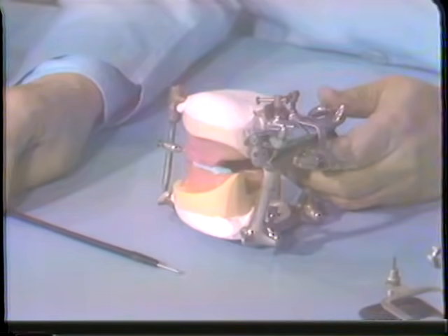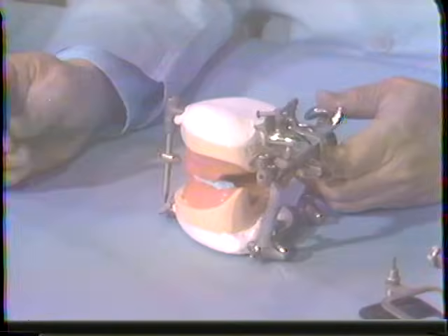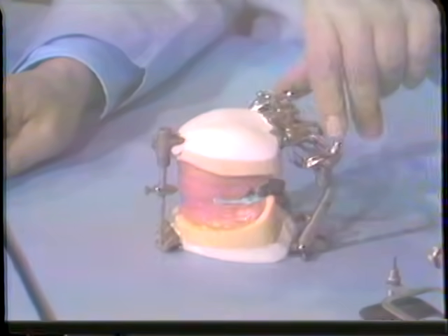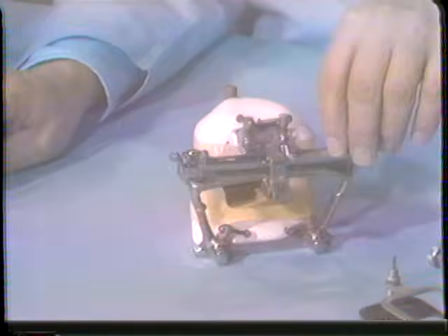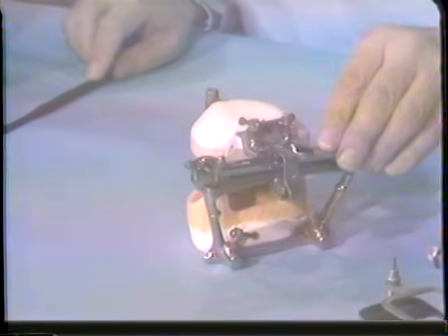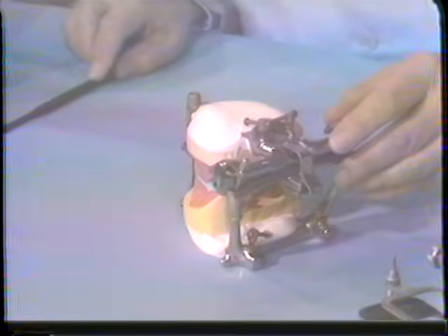He made external tracings on the faces of these individuals, and he found out that on the average there were about 30 degrees. So he incorporated that inclination in these mechanisms on the instrument, and it's a well-known instrument all across the country, still used widely. All of these, as I indicated earlier, are used currently across the country.